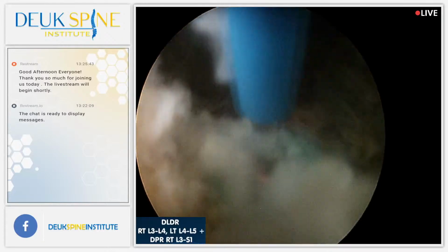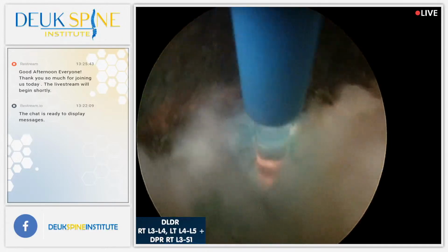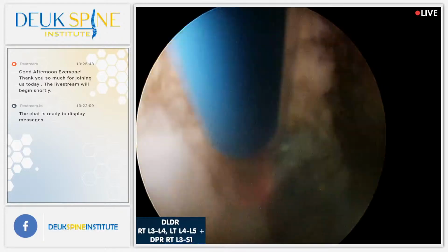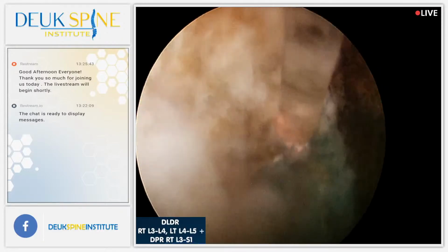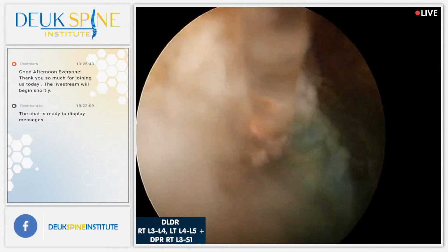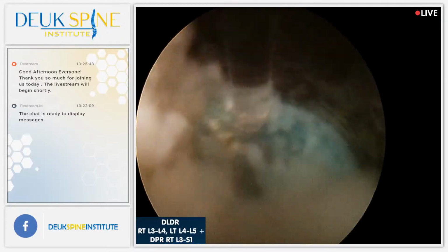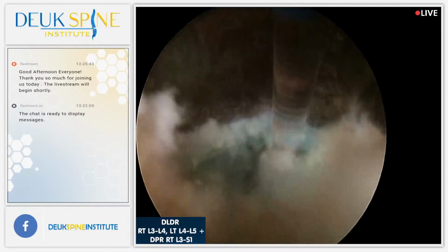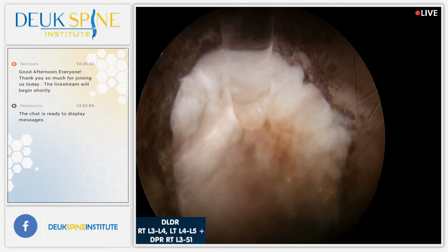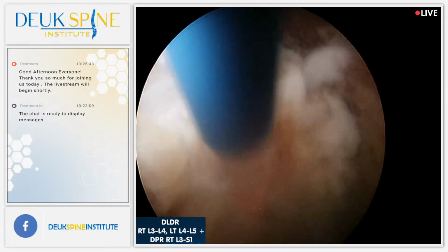It would be interesting to see the effect of straight cut versus angled, to see if there's a difference when you cut the surface. Because what I think happens is when you have a straight cut, it allows the entire flat surface, the whole circle, to work properly. But when you have a diamond, like an angled, beveled cut, then it directs the energy through the bevel and there's less surface area interacting.